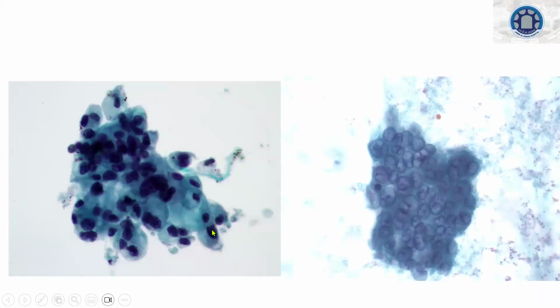So this is pancreatic ductal epithelium. But where is the honeycomb pattern? Honeycomb is all abnormal. And this is called drunken honeycomb pattern. The honeycomb is all drunk and in different ways, seeing this side and that. And you are seeing these kind of high-grade atypia in the nucleus. And here also, if you see, this is called washed out nucleus. And there is lot of atypia here. But it is hypochromatic, not hyperchromatic, but still it is abnormal. It is abnormally hypochromatic, okay?